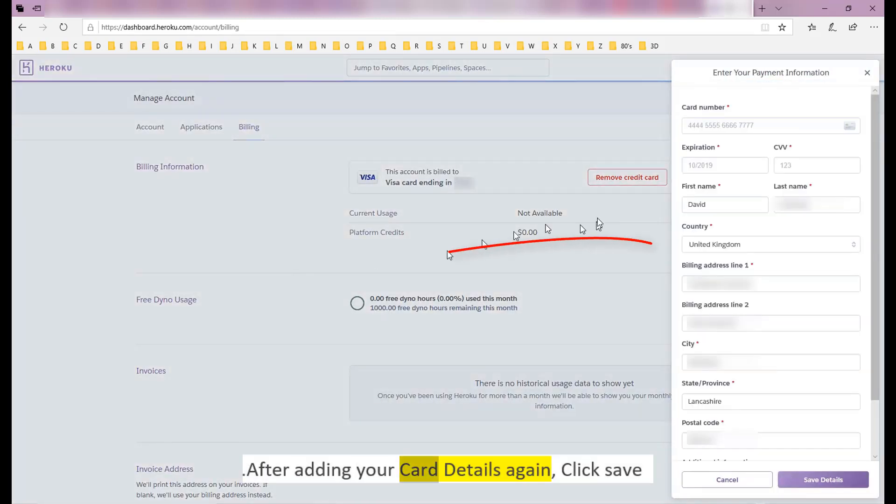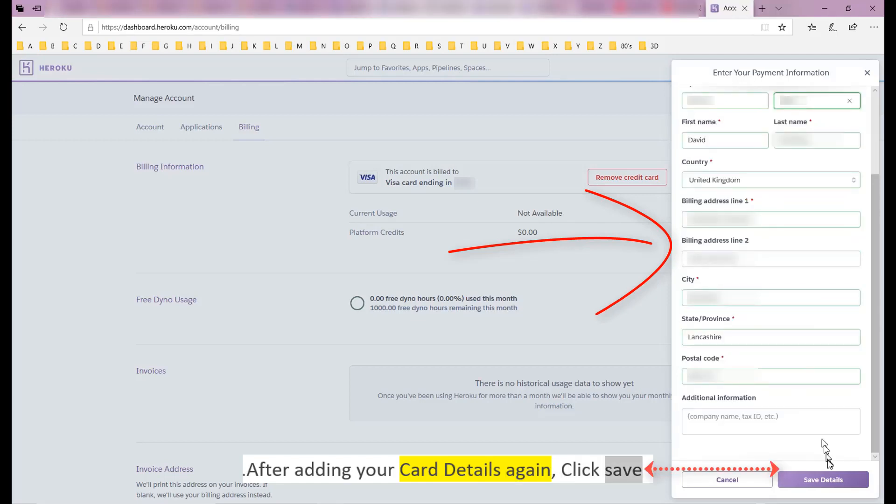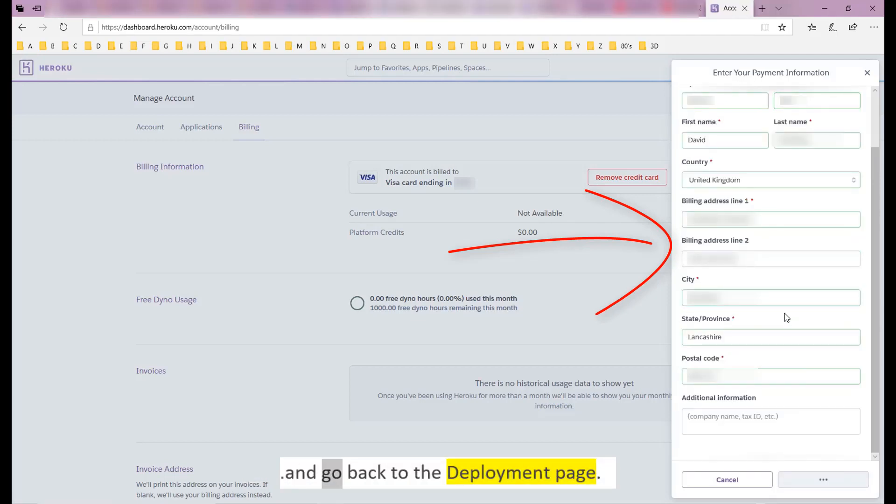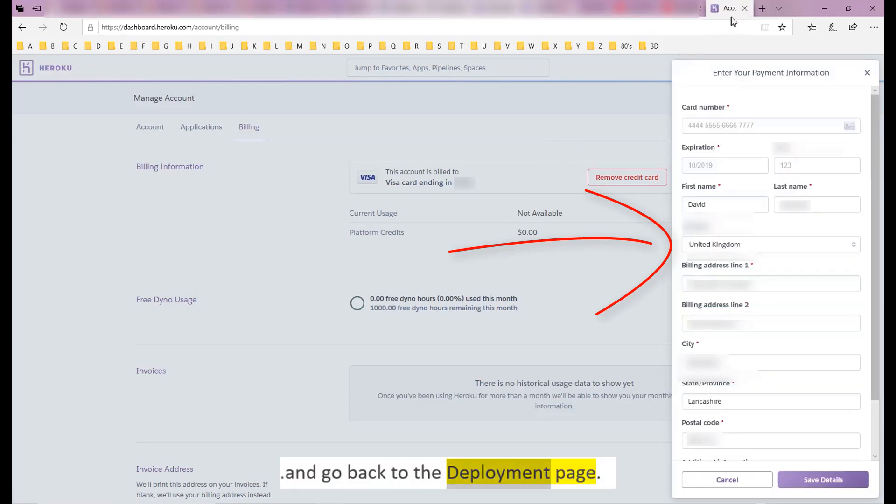After adding your card details again, click save and go back to the deployment page.